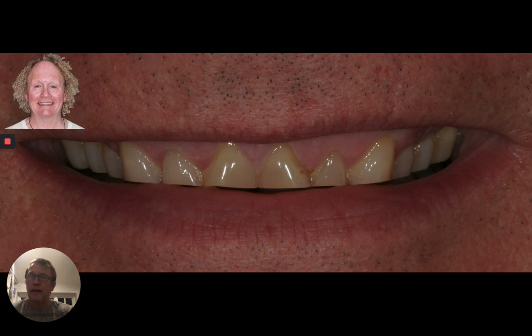So we'll talk about our key diagnostic reference points: upper incisal edge, lower incisal edge, and vertical dimension, how to determine the vertical dimension for each case that you're going to treat, and then how to record that so that as we move forward to a full diagnostic wax-up and developing our digitally designed prototypes, we have the aesthetics and function as perfect as we possibly can to give ourselves as little work as possible when we come to placing the provisionals. We'll talk about different ways of providing the provisionals and placing those, whether that's using a stent, whether that's printed, milled, etc. So we'll talk about those.